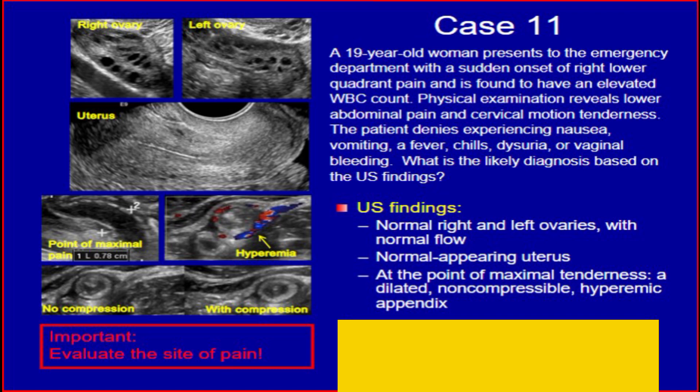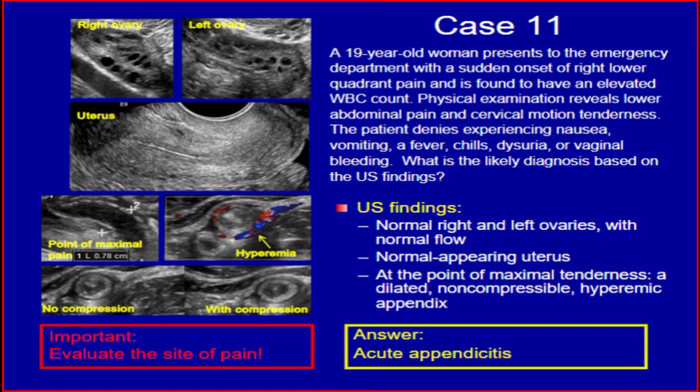Ultrasound findings: normal right and left ovaries with normal flow, normal appearing uterus. At the point of maximal tenderness, a dilated non-compressible hyperemic appendix. It is important to evaluate the site of pain. The answer is acute appendicitis.